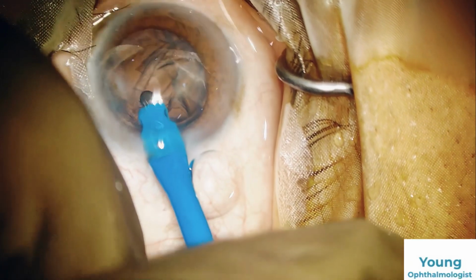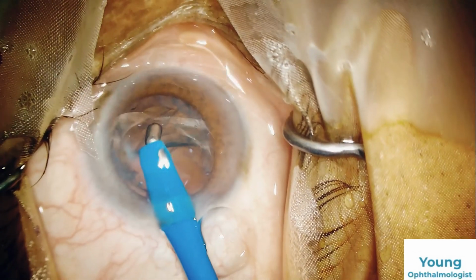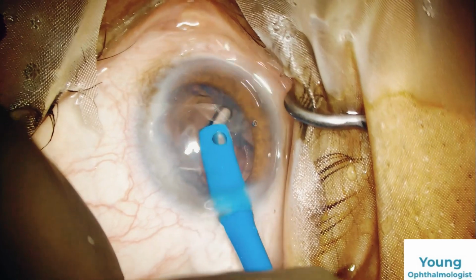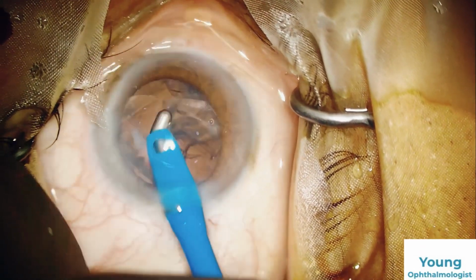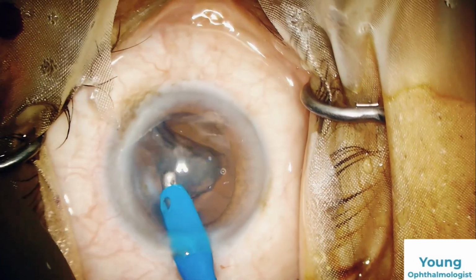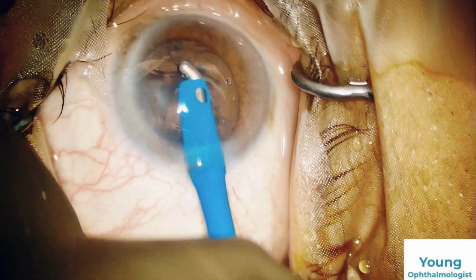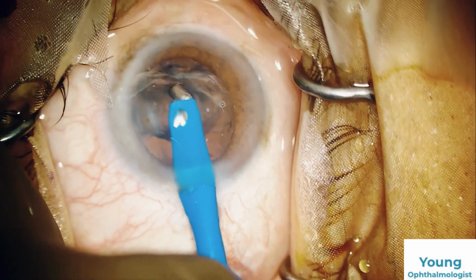Here you can also use Phaco 3 with the help of the Phaco probe, but I directly went straight away for aspiration as the epinucleus and cortex was free and easily removable after doing the hydrodissection. As you can see, the adhesions are broken and we can easily aspirate the cortex and epinucleus.